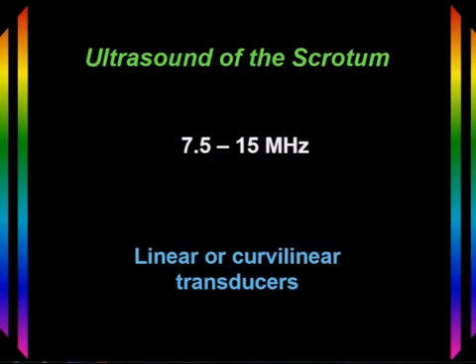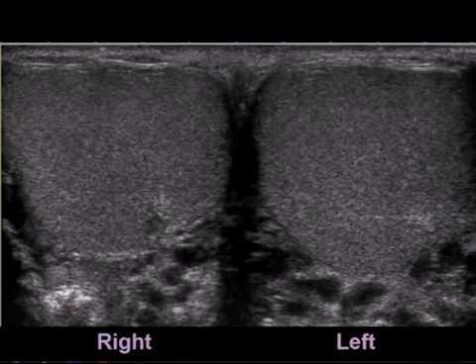The scrotum is ideally suited for evaluation by ultrasound because of its superficial location. We use high-frequency probes of 7.5 to 15 megahertz frequency, and these probes are typically linear or curvilinear transducers.